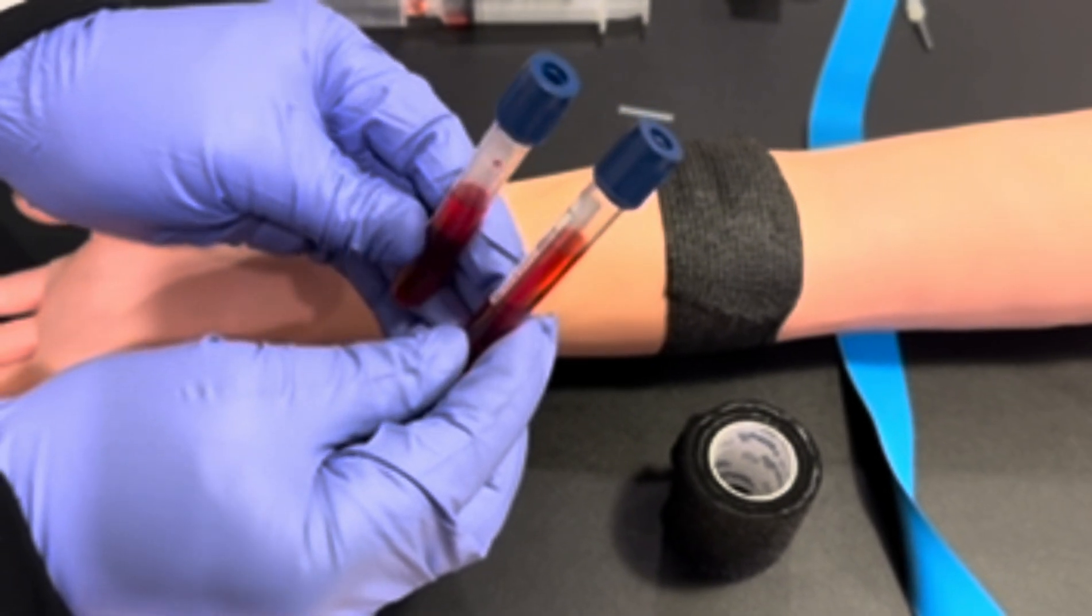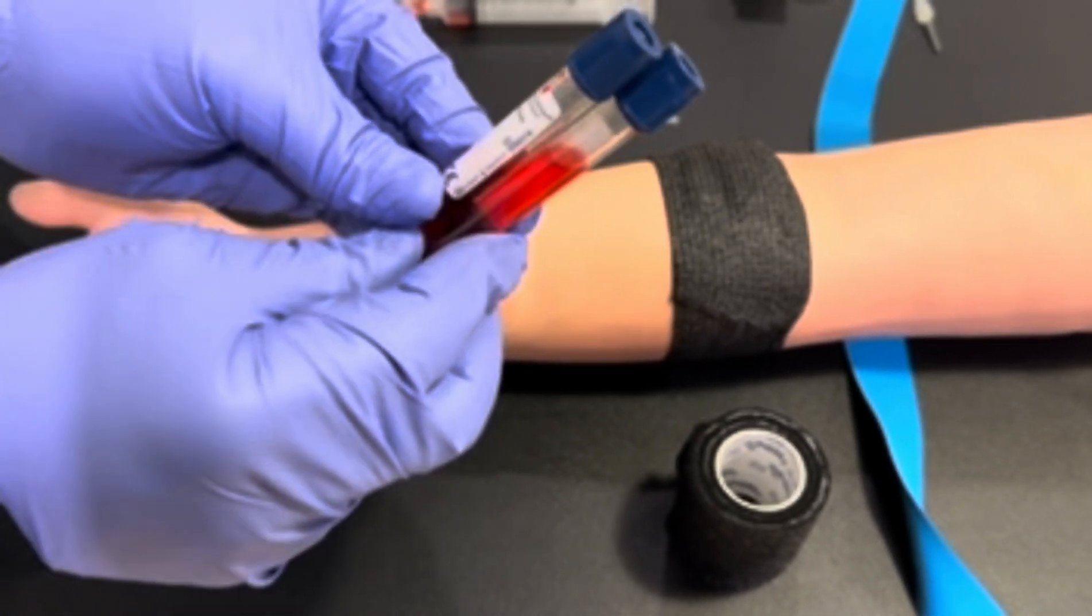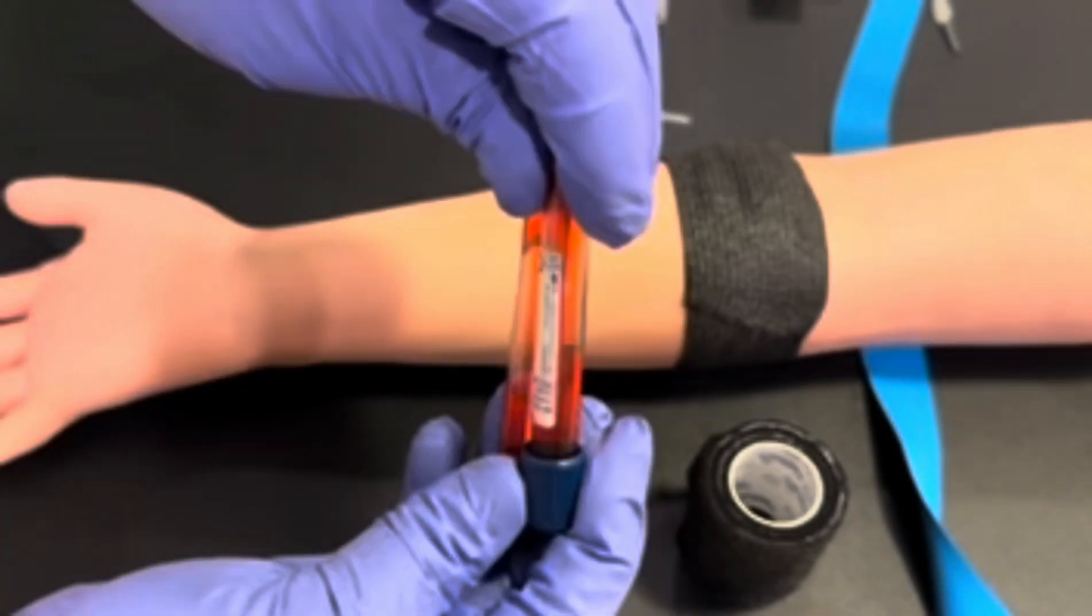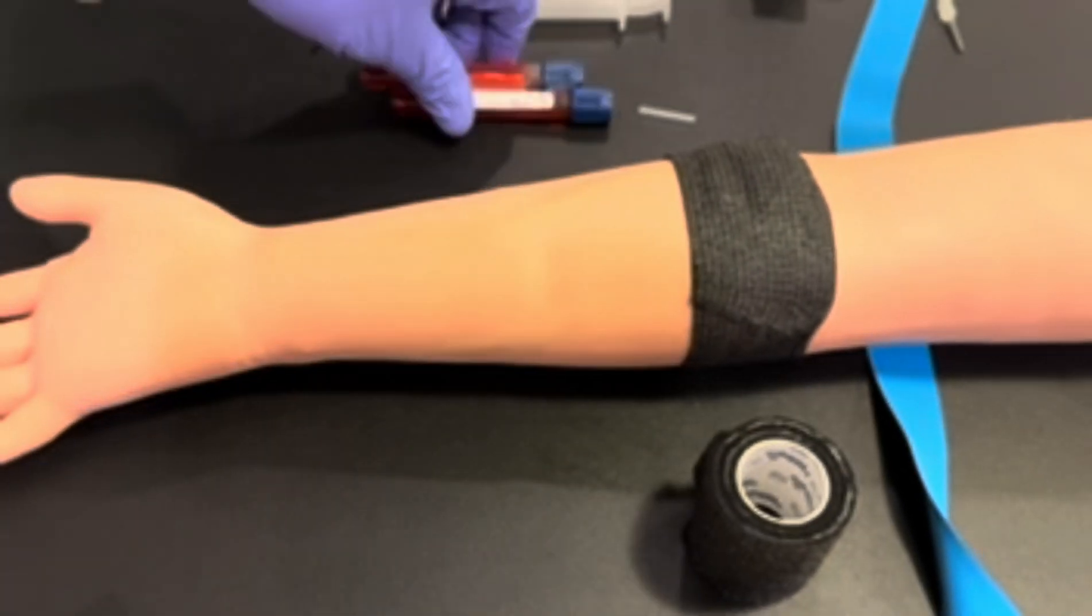Make sure you take a look at your tubes. Invert your tubes 8 to 10 times. And thank you for today.